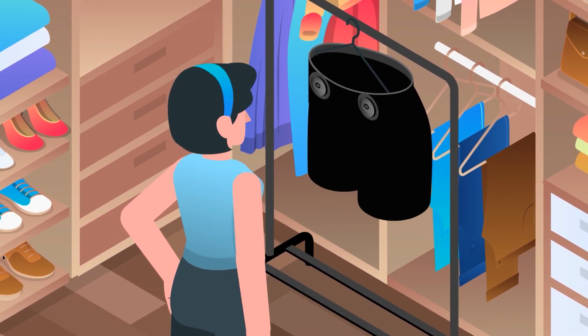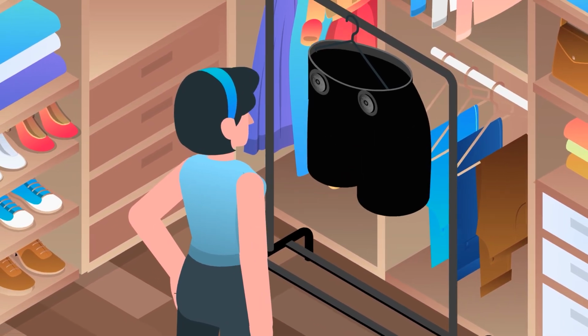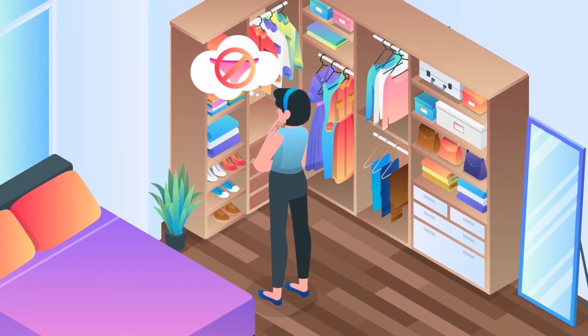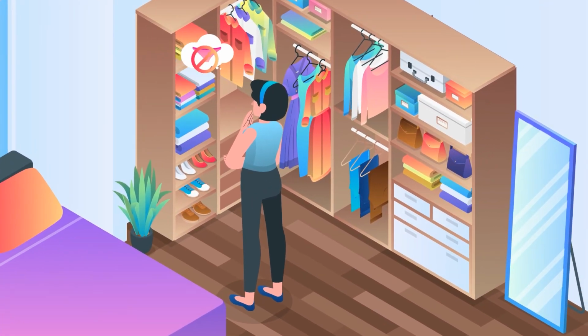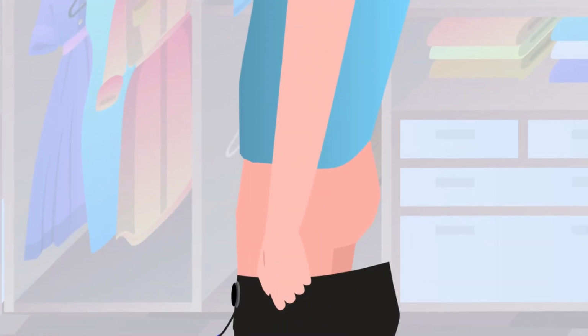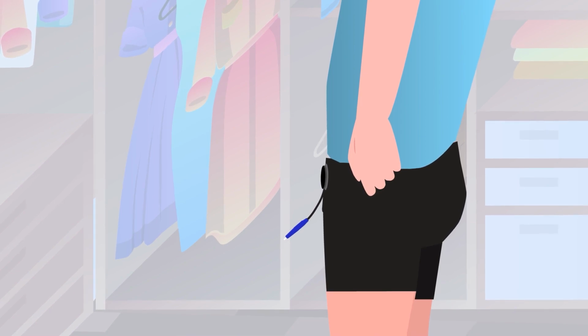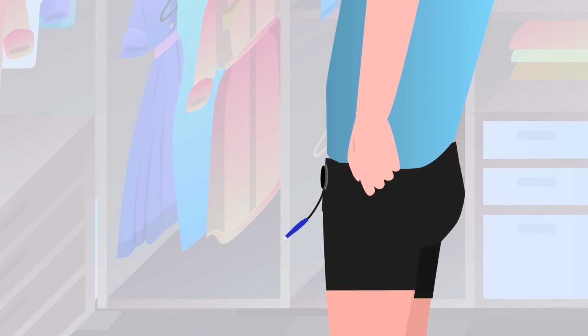Reverse the shorts so the electrode panels are on the inside. In order for the shorts to work, you will need to wear thong underwear or no underwear with INNOVO. Pull on the shorts until the waistband is sitting comfortably above your hips. The red and blue connectors should be to the front, with the wash label to the rear.